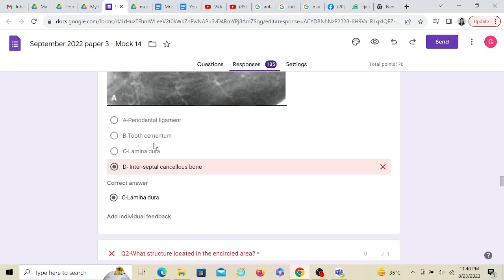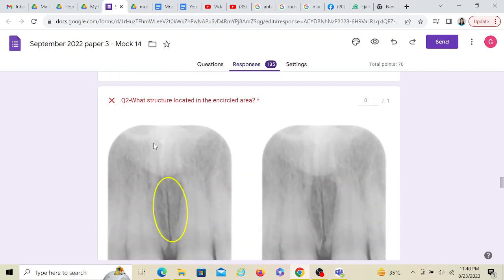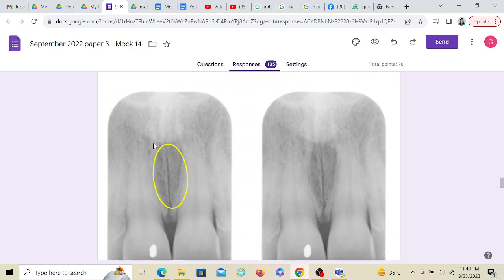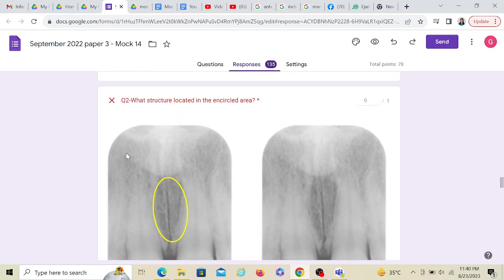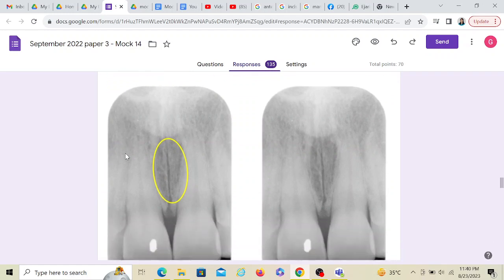Let's see what the options are. Periodontal ligament - ligament would always be a soft tissue, so it would appear radiolucent. The arrow is marking at a radiopaque structure. Tooth cementum - the arrow is not pointing at the tooth cementum, it's stopping right here. Lamina dura - yes. Interseptal cancellous bone would be this and this, but the arrow is not pointing at that. Hence the answer: lamina dura.